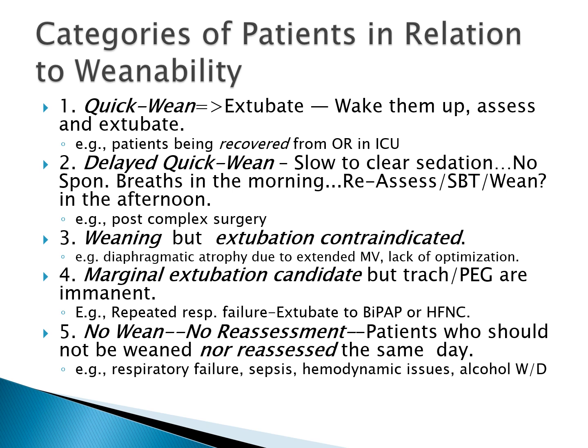Now let's take a look at the categories of patient in relation to weanability. I think that's a word. I'm not 100% sure, but weanability: the ability to have a reasonable prospect of successful weaning and hopefully eventual extubation. So the quick wean extubate: basically wake them up, assess, and then extubate. That might be post-surgical patients. Many times their biggest barrier is they still have anesthesia on board, some sedation on board, etc. Delayed quick wean: slow to clear sedation, no spontaneous breaths in the morning, reassess them in late morning or early afternoon and see how they're doing.